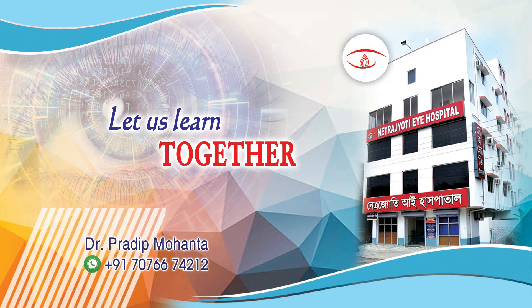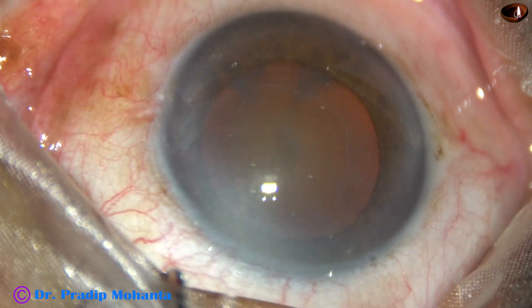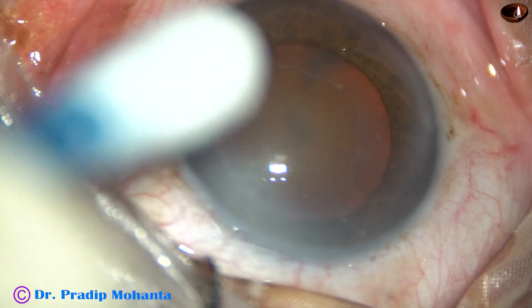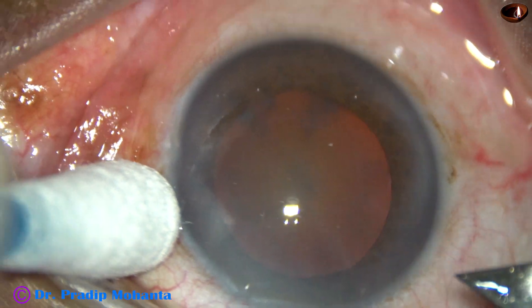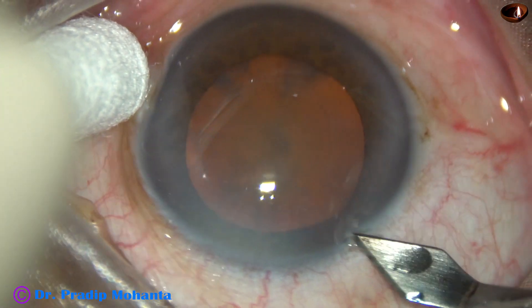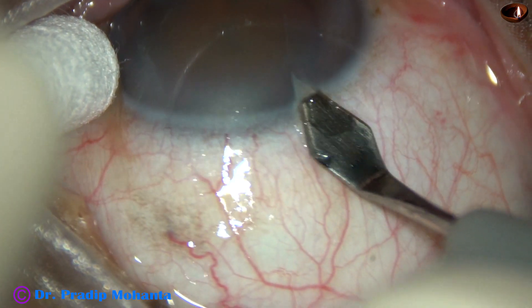Friends, welcome to my workplace at Rana Ghat, West Bengal, India. This is a cataract with pseudo-exfoliation. We can see the pseudo-exfoliation material on the peripheral part of the anterior capsule. I have taken up this case for surgery. Let us observe the surgical steps.